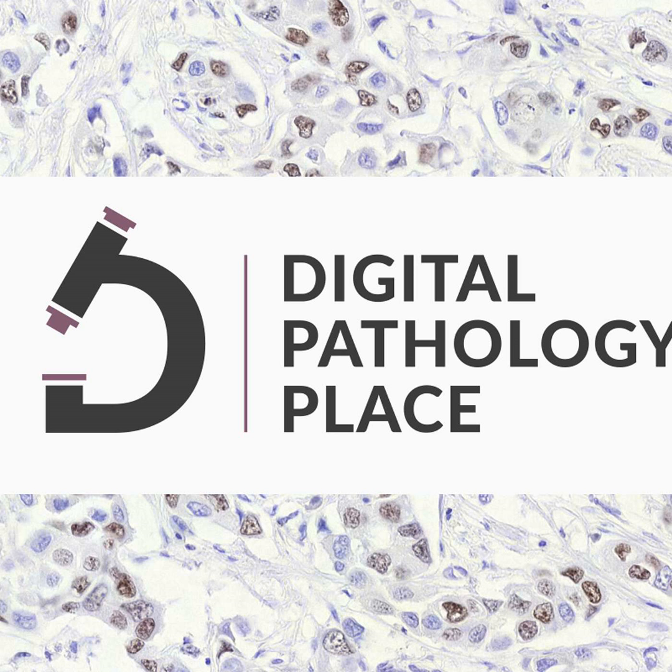Like the staining. Exactly. Maybe a new batch of reagents is slightly different. Maybe tissue processing or section thickness has subtly shifted. Maybe even scanner calibration is off. The drop in AI performance is actually a symptom telling you that your upstream lab processes need attention to bring them back into control. That's a really important way to think about it. The AI becomes a kind of canary in the coal mine for your pre-analytical variables. In a way, yes, it demands consistency in everything that comes before it. So how do labs actually do this ongoing monitoring? It involves a couple of layers.